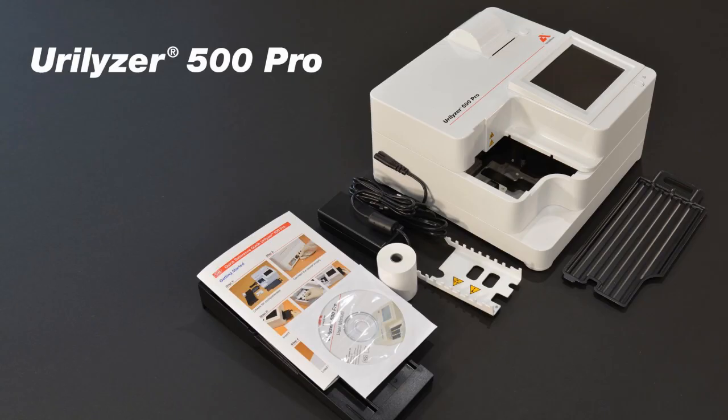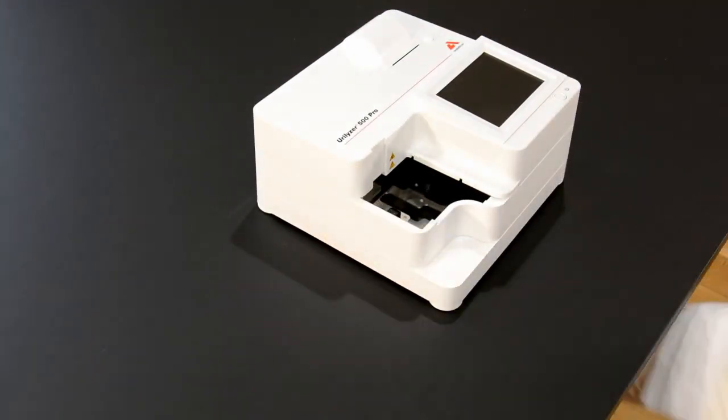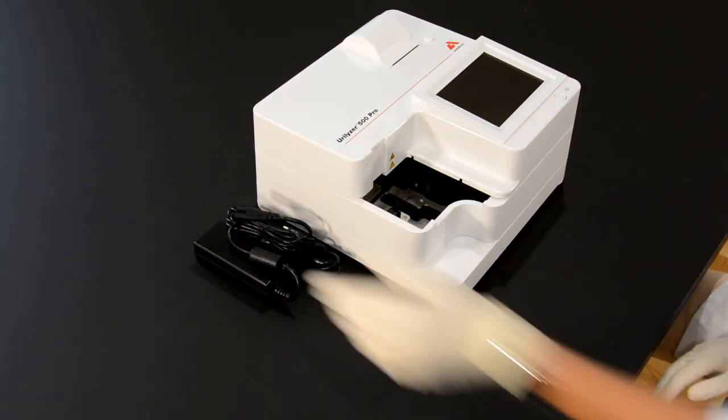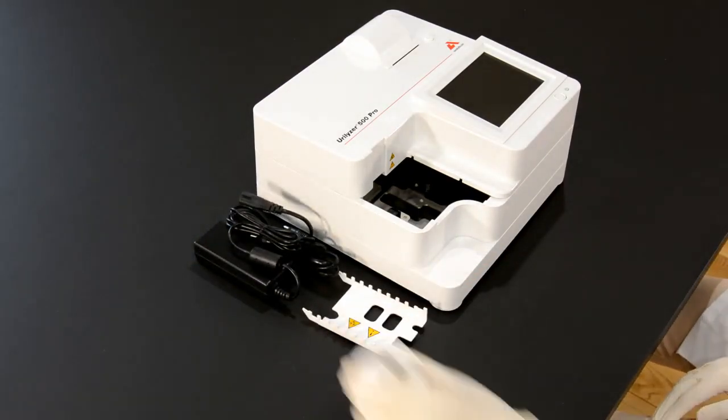The Urilyzer 500 Pro is a semi-automated urine test strip analyzer of the latest generation. The high throughput of up to 500 tests per hour in combination with state-of-the-art operator and data management functions provides the ideal system for mid-size to bigger laboratories and for hospitals.